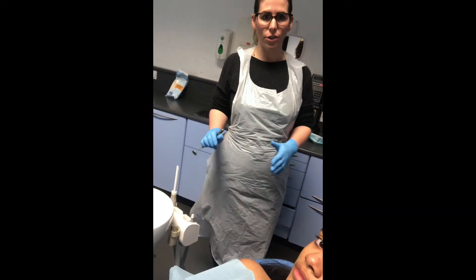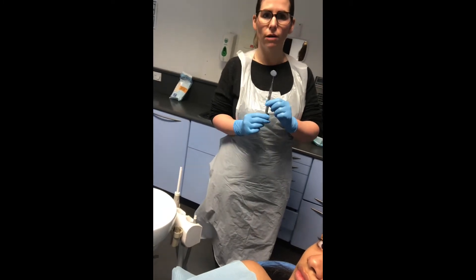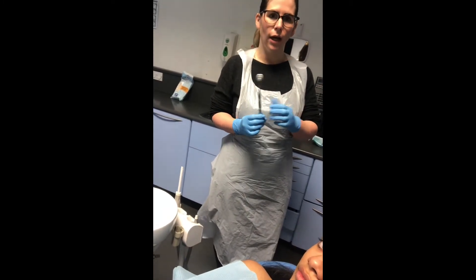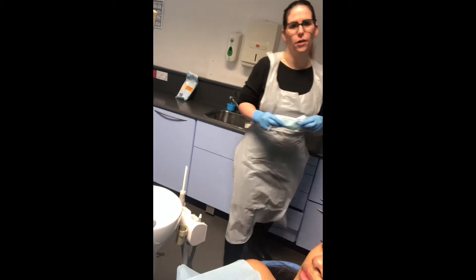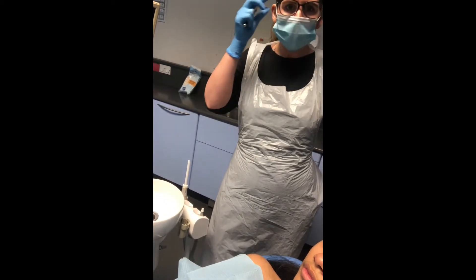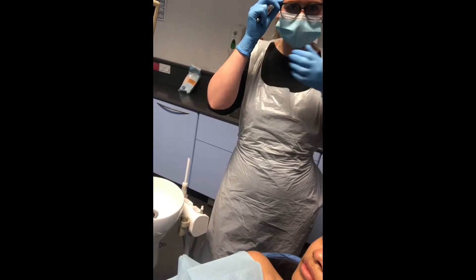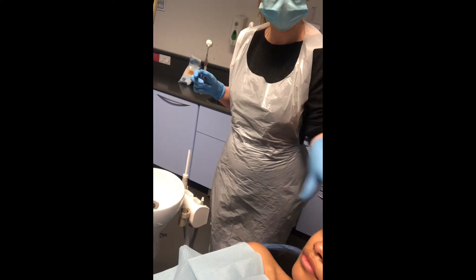Today's video I'm going to show you how to aspirate, how to manage the aspirator, also using a mirror for retraction as well. For the purpose of the video I'm wearing glasses today just to show your PPE, but you have your visor on anyway, and your mask, and then your patient would have their bib and their goggles on as well.